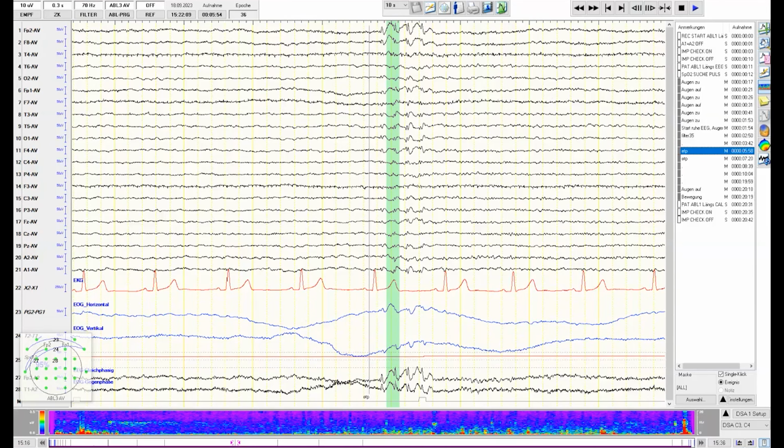And where do you need it? I understood that you use the EOG to see the artifacts from the eye movements, but also this differentiation between horizontal and vertical. Do you also use it for further analysis? So not only to see if the eyes were moving, but do you also use it differently for other things?